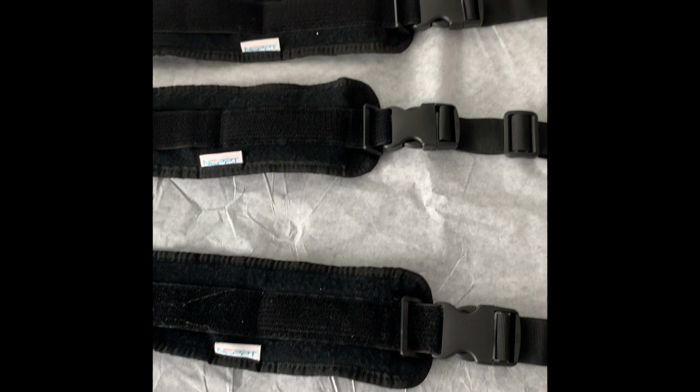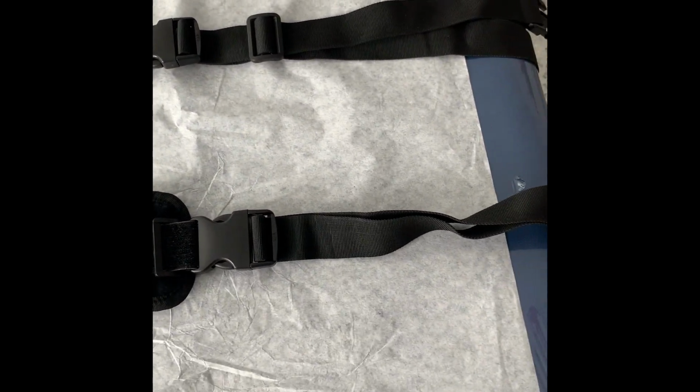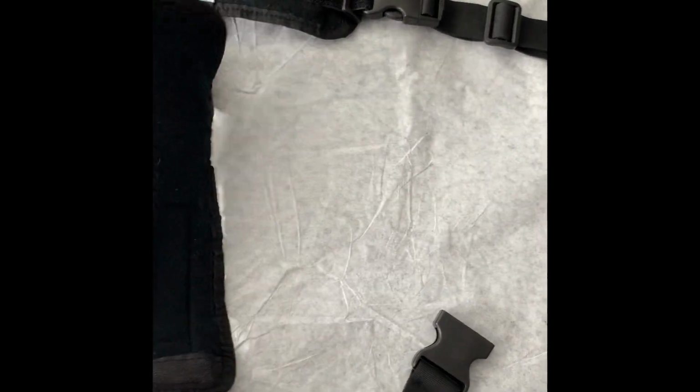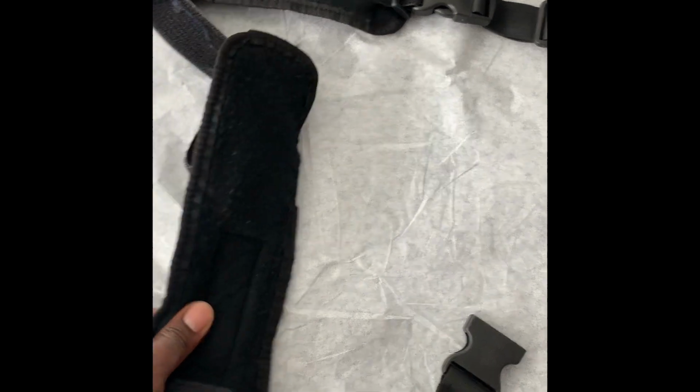All right, so like I said, these are soft restraints. It can be used. It needs to be ordered by a nurse or a doctor. A nurse has up to 1 hour to keep a restraint on a patient statewide, and the doctor could decide to keep it on further. But this is how you use the restraint. So when you come practice your skills, this is exactly what you do.